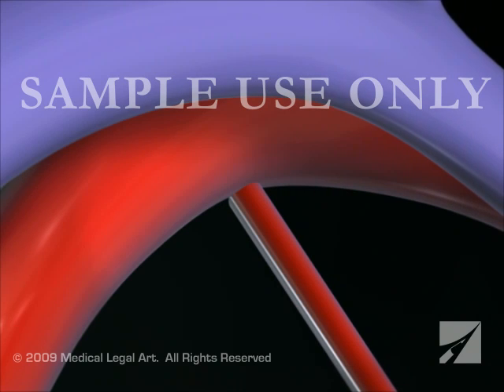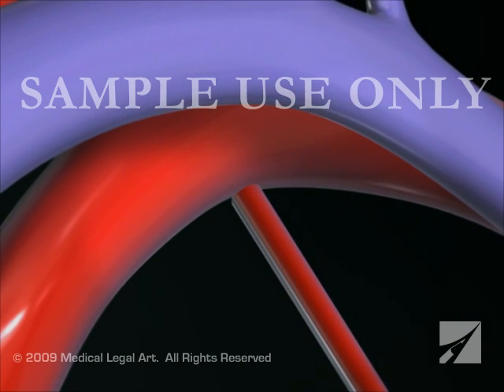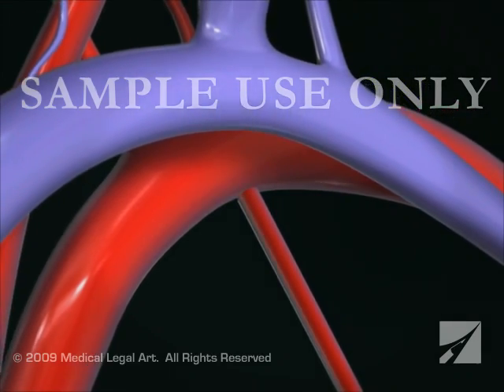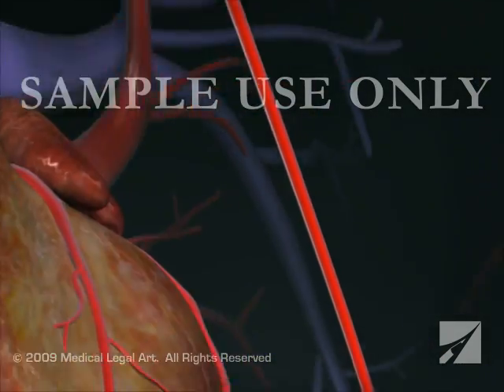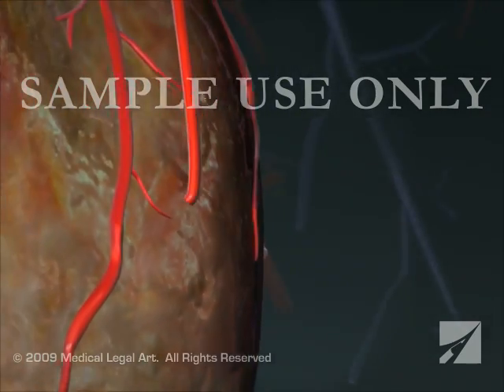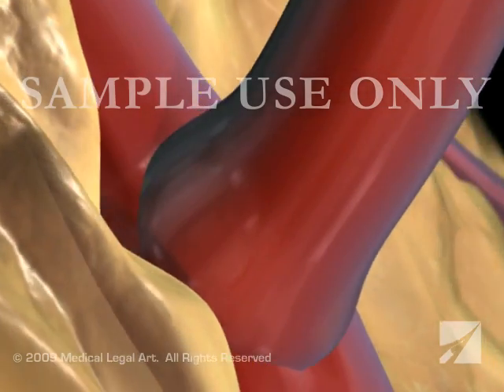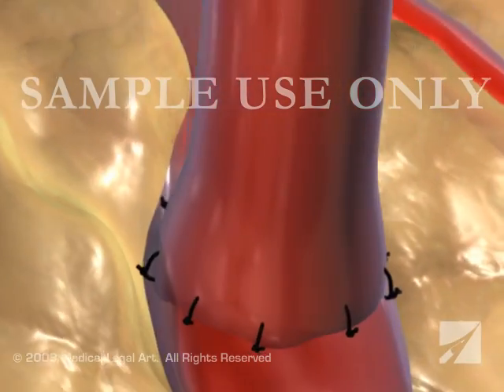For the internal thoracic artery graft, your surgeon will leave the upper end attached to the subclavian artery and divert the lower end from your chest wall to your coronary artery, just beyond the blockage. Your surgeon will then sew the graft into place.